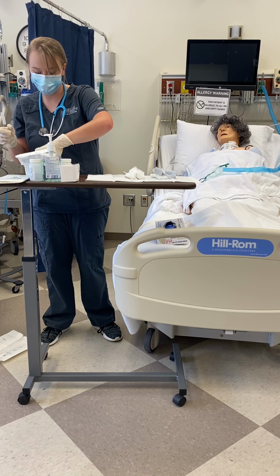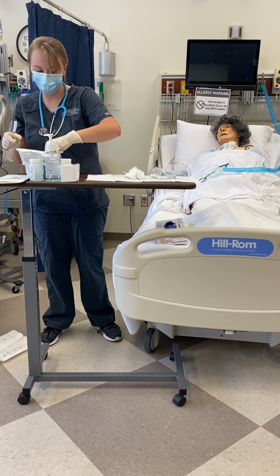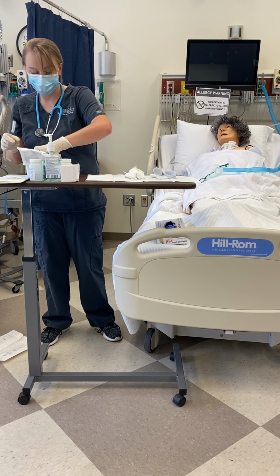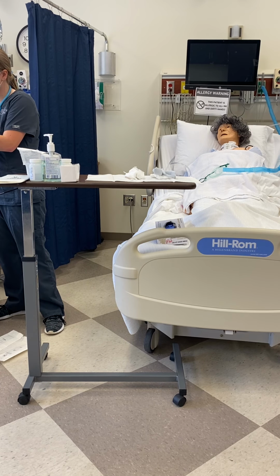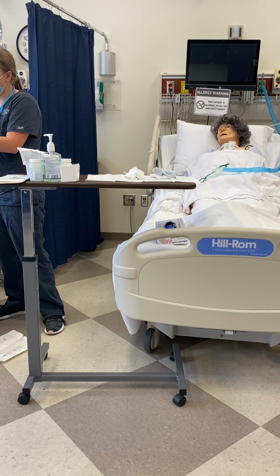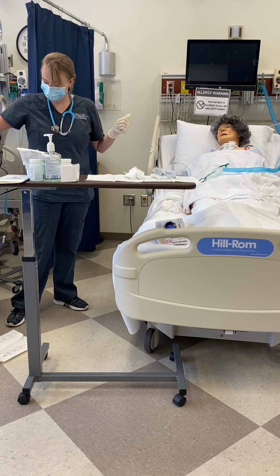Alright, then once it's soaked a little bit, I'll bring it over a trash can just so I don't get my sterile field dirty, and clean all the way in it and on the outside. And then drop it into the clean water, or the sterile water.